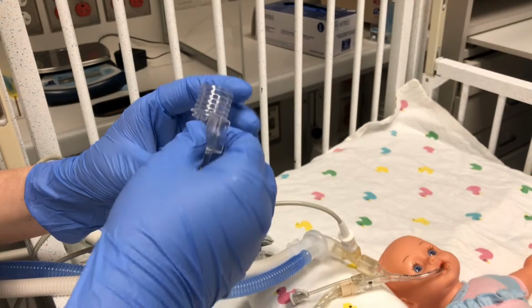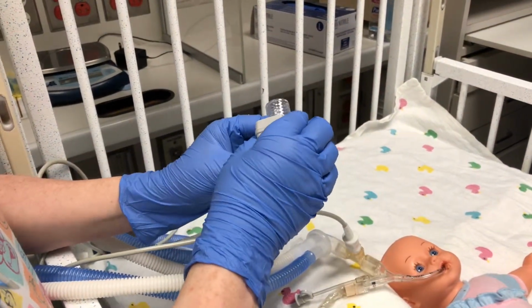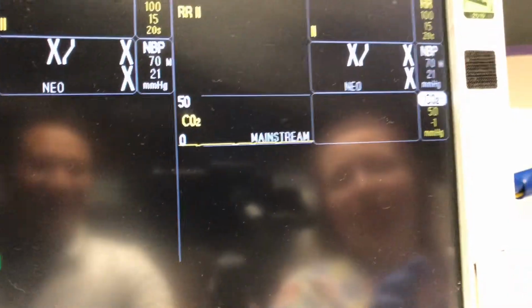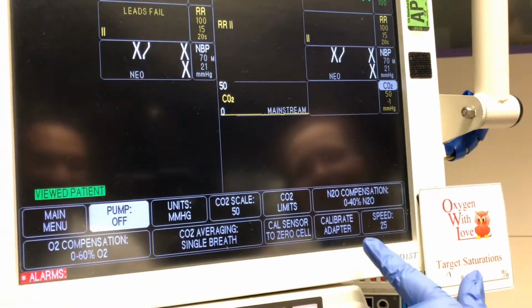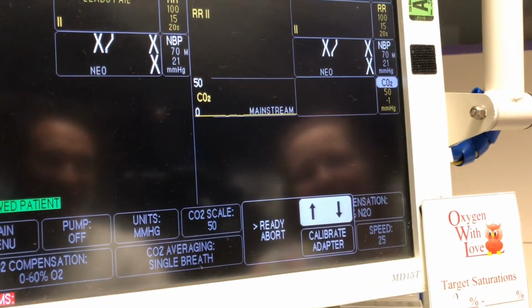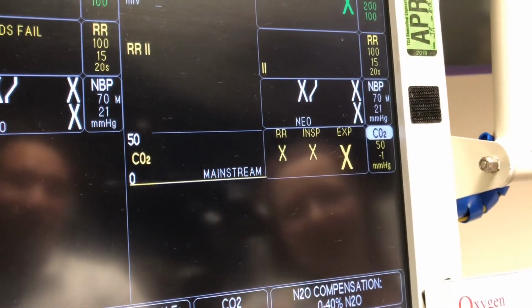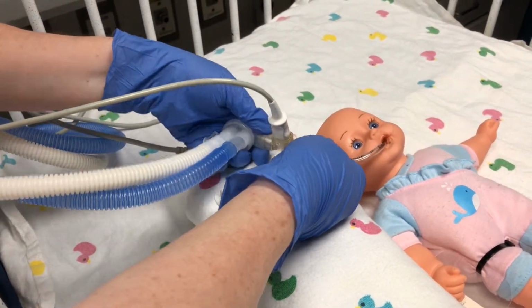Okay, so once you've gotten out as much moisture as you can, you'll slide it back into the adapter, and then you'll want to calibrate the adapter again. So you'll come over to your monitor and you'll hit CO2. So in order to recalibrate the adapter, you're going to press on CO2, and then down here where you see Calibrate Adapter, you'll press it once. You'll press it again. So once you've recalibrated your flow sensor, you'll put it back in line.